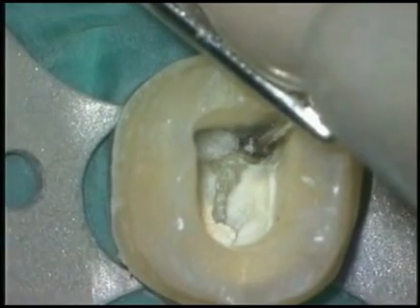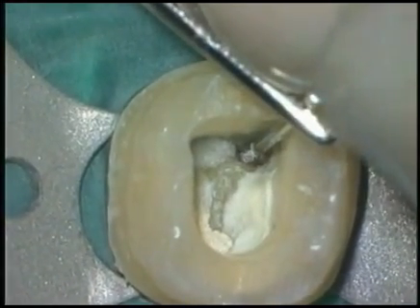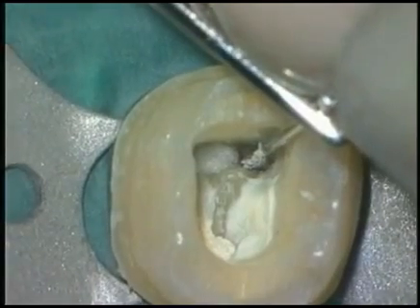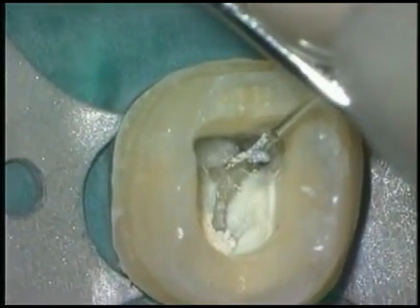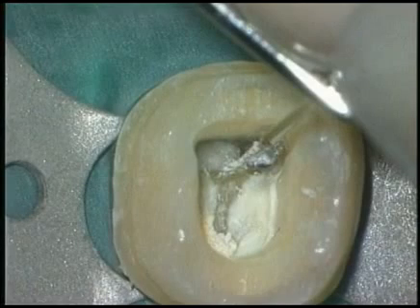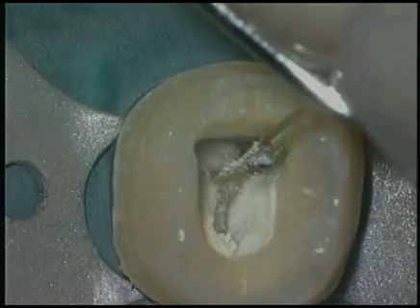When the apparatus is removed, it's pretty exciting to see that the broken instrument is retained. Notice its curvature and notice all the debris on its cutting flutes. Clearly, this broken instrument was very securely bound in the root.